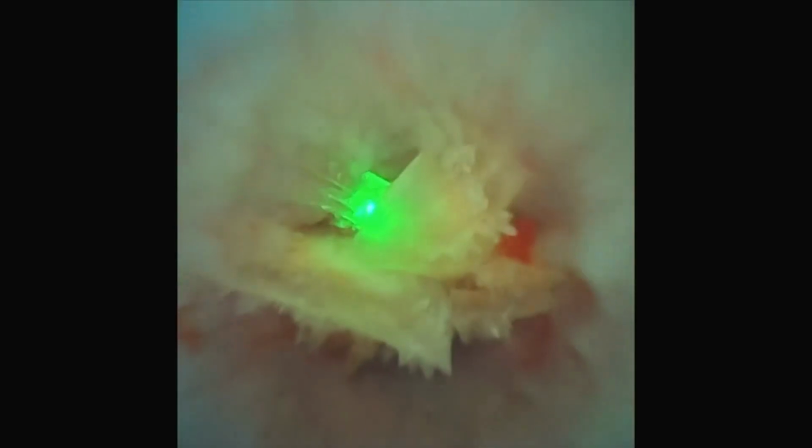Now here's an example I'm going to show you of an impacted ureteral stone. This was done in the operating room with gravity irrigation. So often with these impacted stones, you can see this is a spiky stone. We try to push the stone and disimpact it. In this case, this stone was too stuck. We couldn't. We put the patient in reverse Trendelenburg position so the pieces don't migrate up to the kidney.